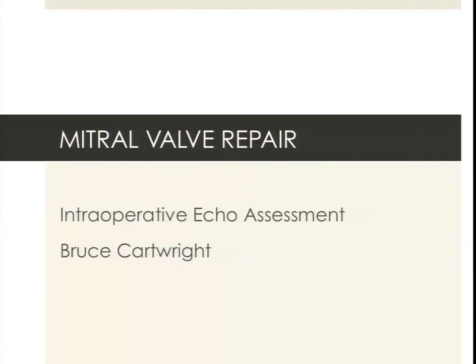So today, because there's lots of topics when you're talking about the mitral valve, I'm just going to talk about repair, and I'm going to try and be a little bit practical for you. I'm not going to talk about the access echo issues, but I will say one thing.